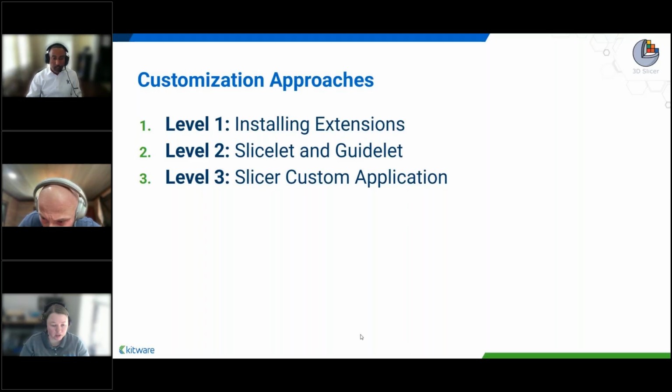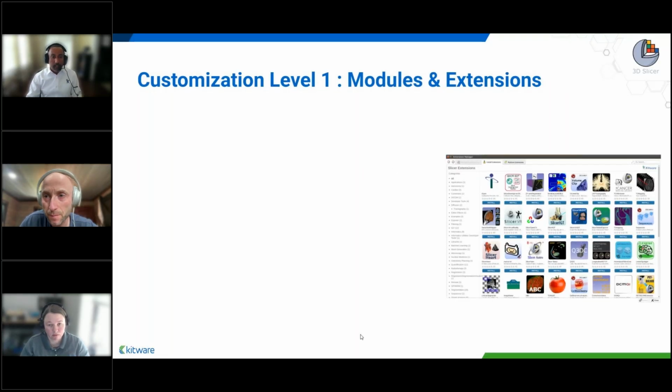Hey Sam, there is a question that just came in. Are there any efforts to make Slicer a web-based tool as well?